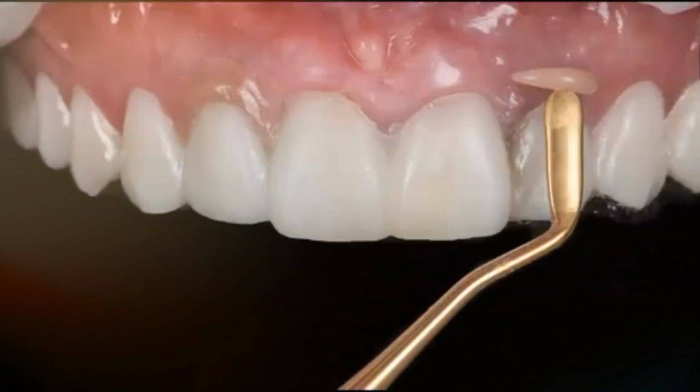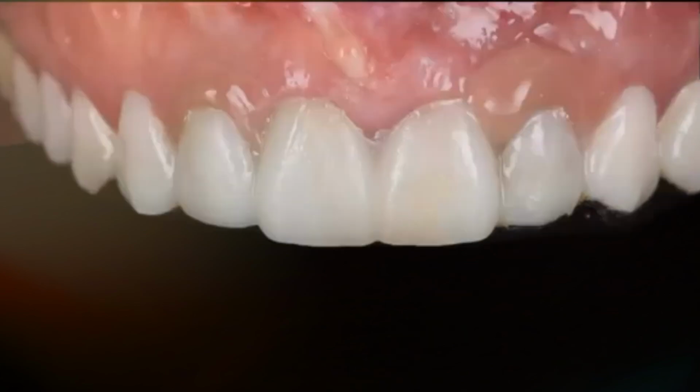And then I take like a pink composite, and I also mask the areas of the gingiva, because otherwise when you do the mock-up, it's going to be an ugly high contrast area with the bisacryl, and it doesn't look nice. And not only that, but that's exactly what we plan to do. So the pink that I put here will be substituted by soft tissue augmentation in those areas.